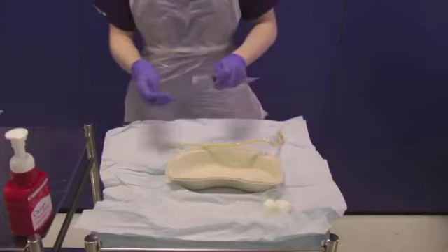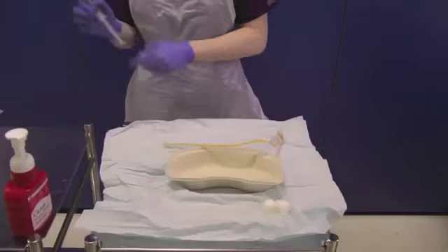Open the 10 ml syringe from its sterile packaging and leave this on your sterile field.